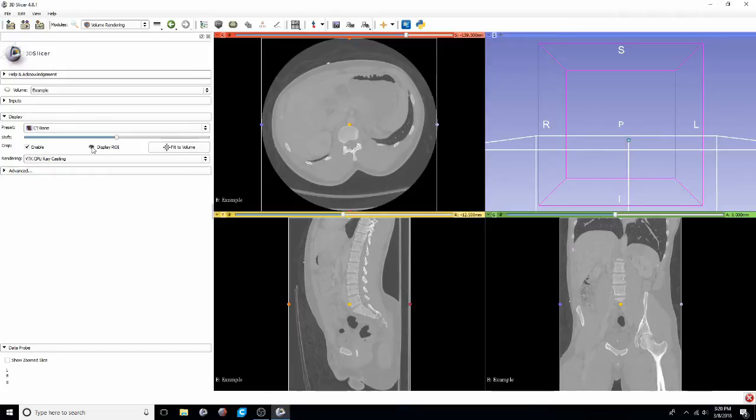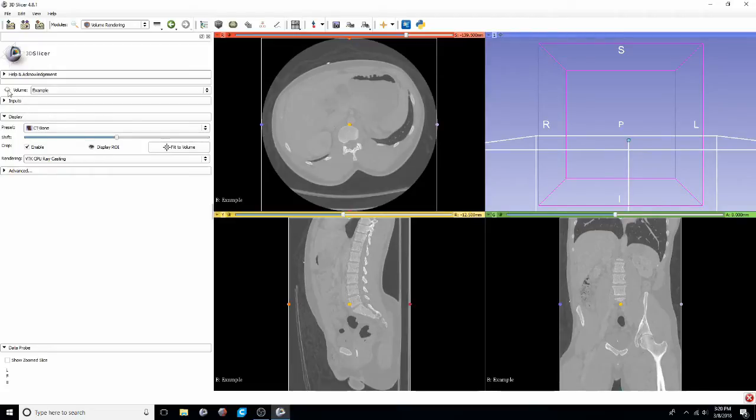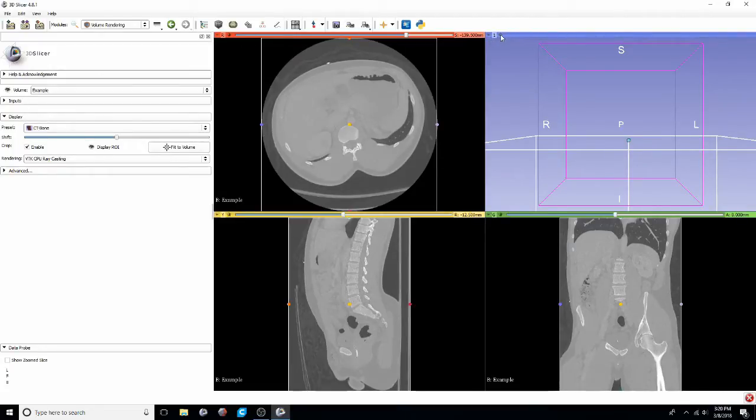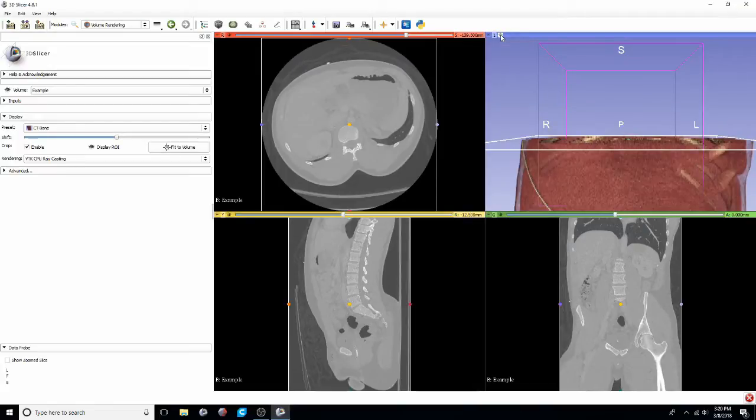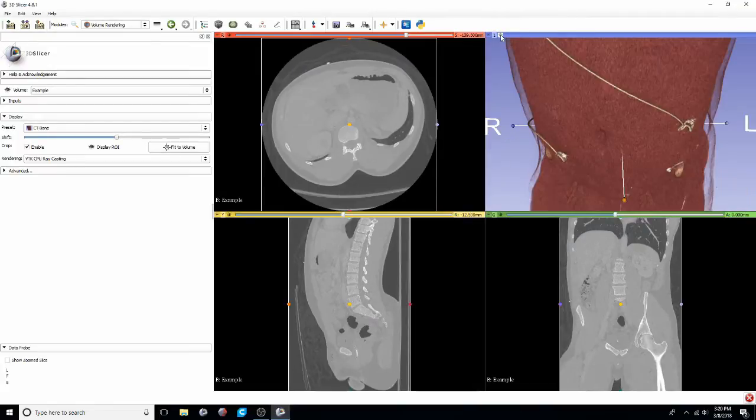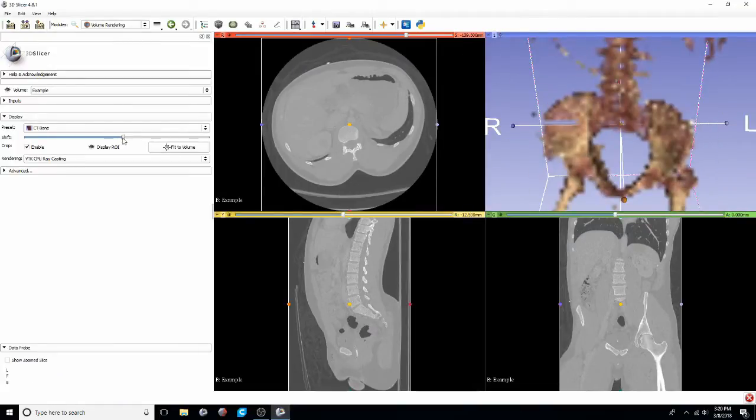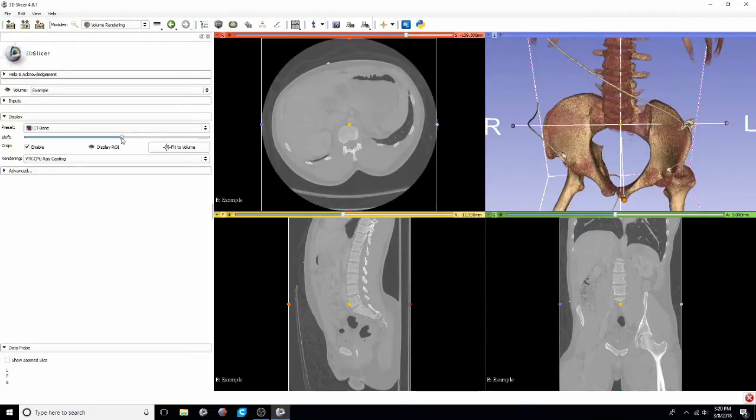We'll show the ROI which will allow us to crop down the volume to our region of interest. Then we'll need to click that eyeball next to the volume to actually see it. Just give the computer a second to load. Changing the shift will allow us to better visualize the anatomy that we want to see.